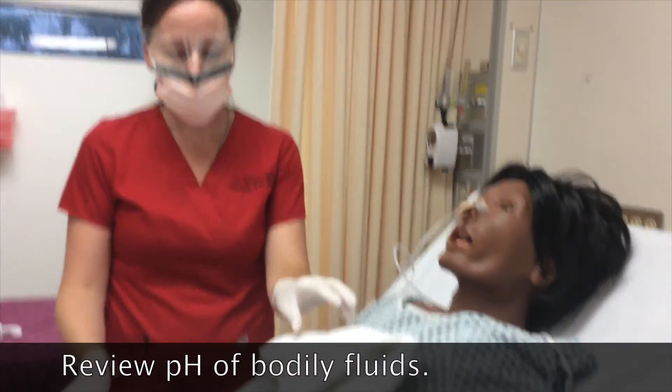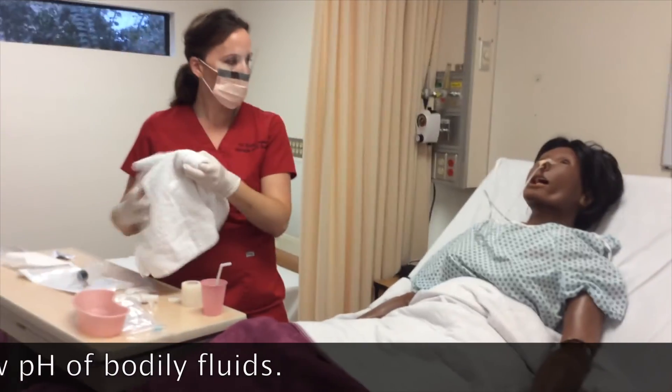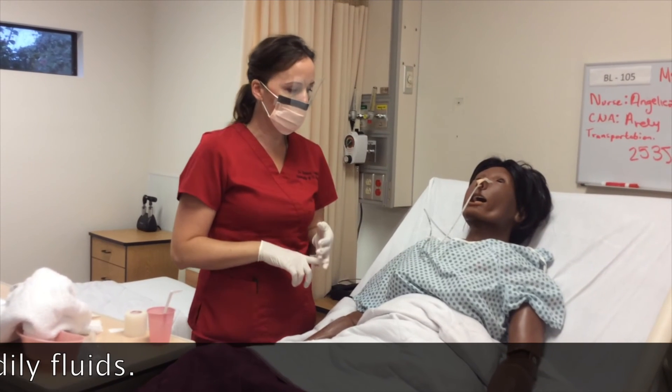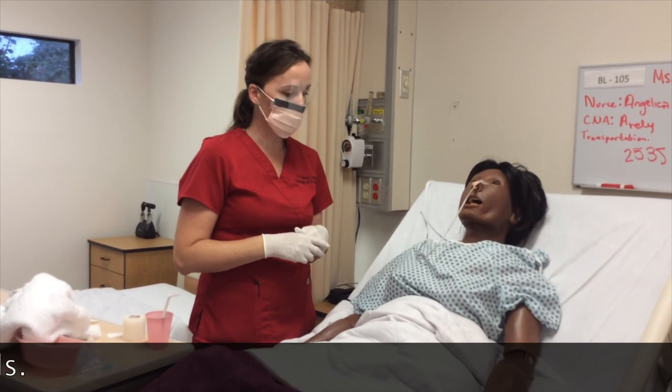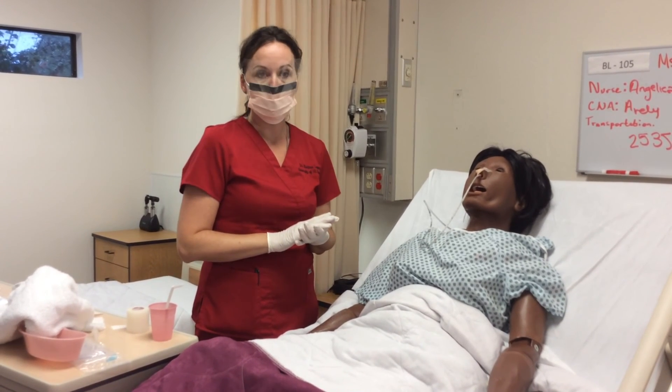I'm done, I can clean up, and I will chart accordingly. Before I use the nasogastric tube for medication, feeding, or anything else — or even applying it to suction — I'll call the doctor to make sure an order has been done to check proper placement.